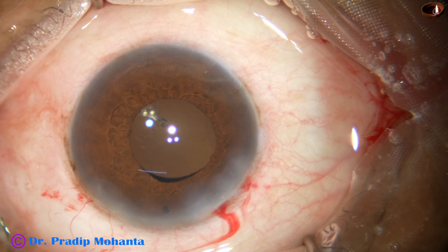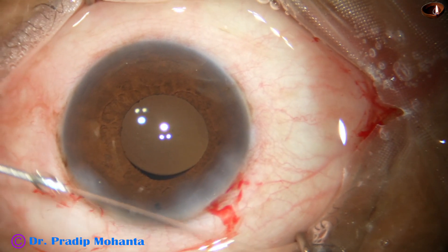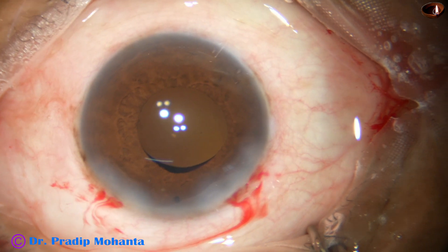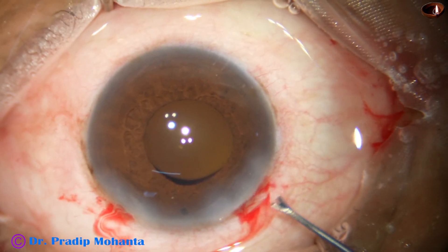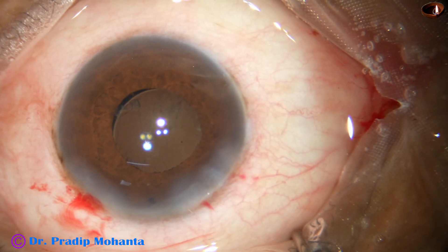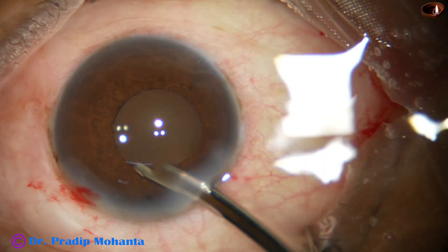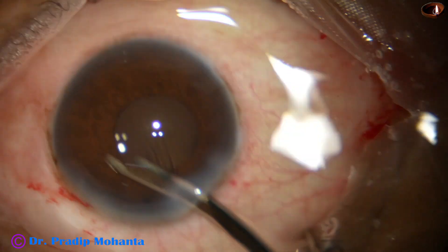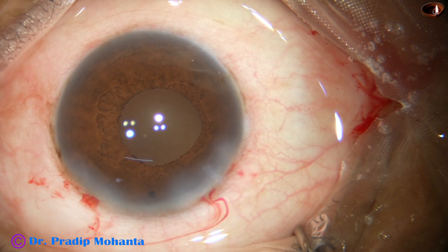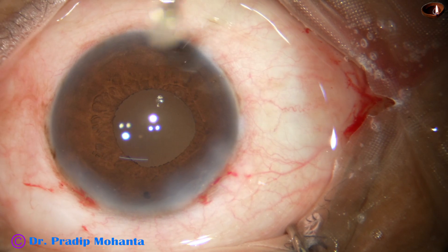This is a bit of moxifloxacin. Now I hydrate the side ports. At this time I should not have used this in this way — there is no visco in the anterior chamber. I should have checked it when there was visco inside. However, I came out before the anterior chamber became very shallow. This is the final lavage of the anterior chamber. The anterior chamber is nicely formed, and the case is concluded. The integrity of all the wounds is checked, and a few drops of moxifloxacin are applied over the ocular surface.